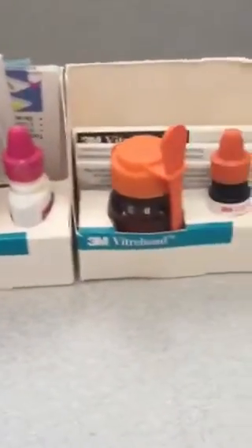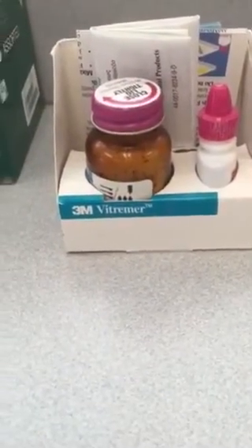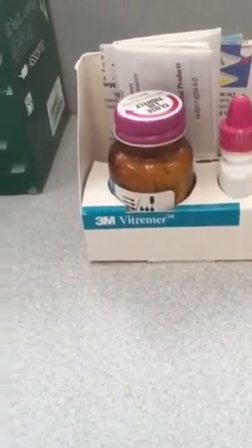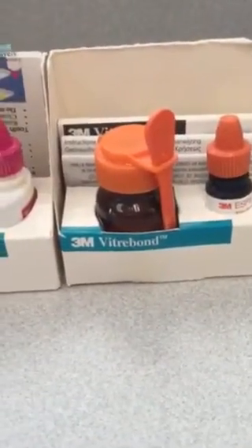This is Vitramir and Vitrabond. Vitramir is used for bridge cements, porcelain crowns, metal inlays, and ortho. Vitrabond is the liner.